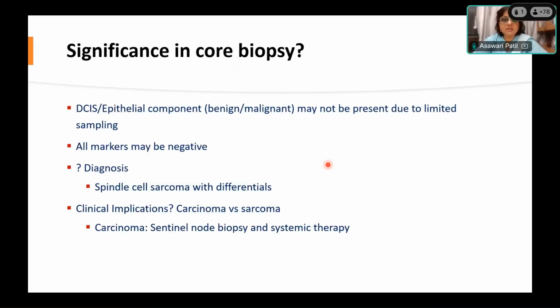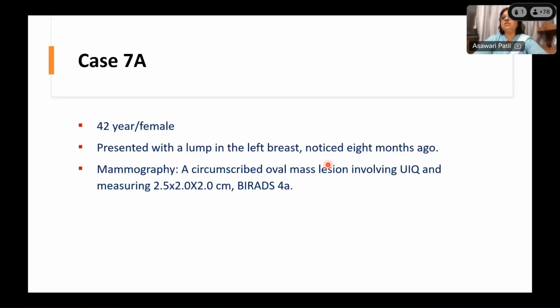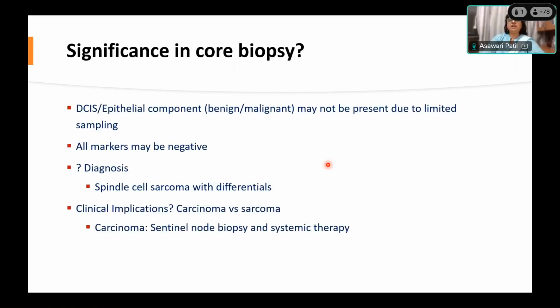Any questions on this? Before I go to the last two cases, Ayushi, any comments, and any comments from chairpersons? I think Dr. Seema, you want to say something? Dr. Renu has raised her hand, madam. I think Dr. Renu has a query. Dr. Renu, can you go ahead with your query? Seema, would you like to comment?